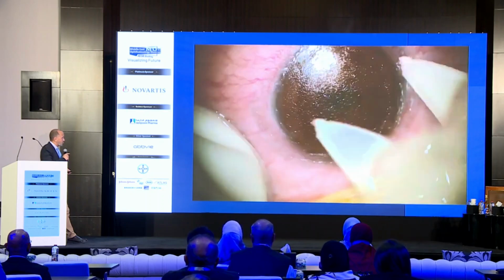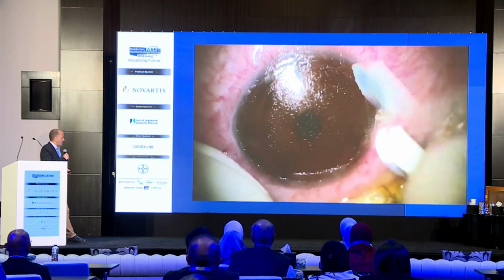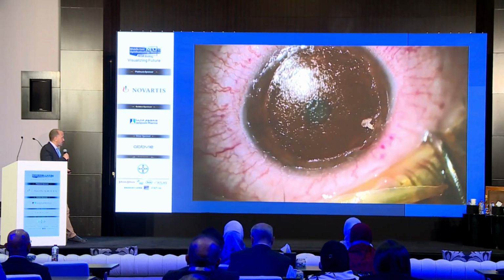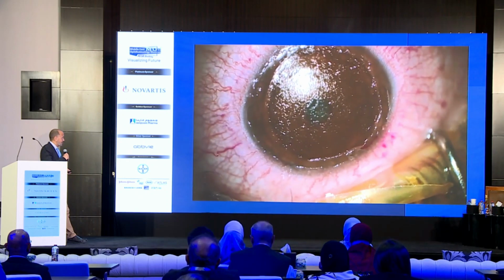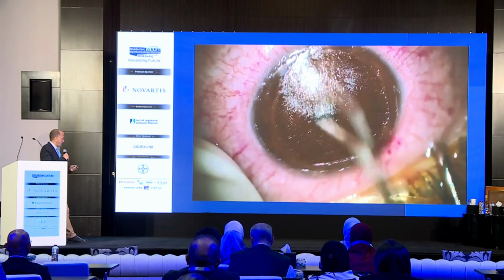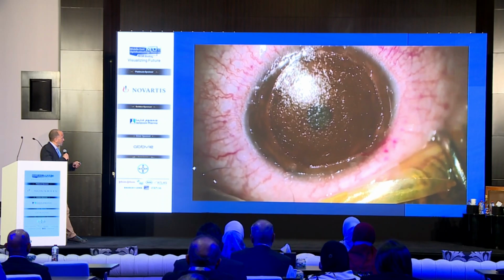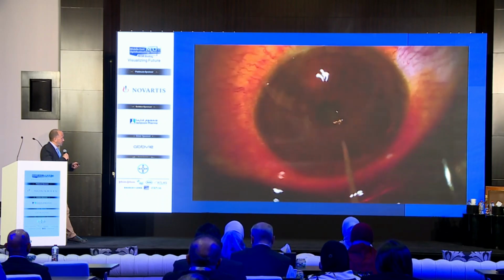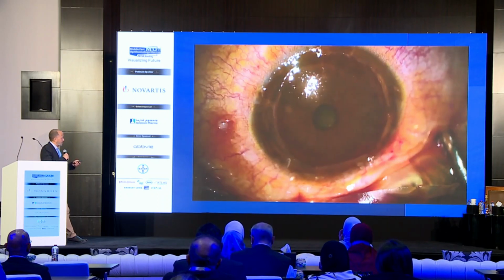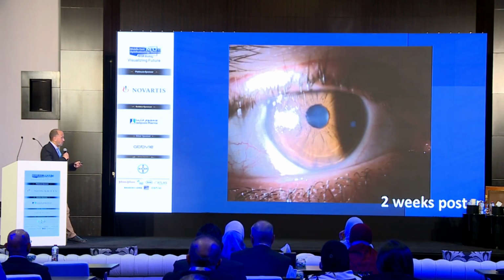Now the stroma started to look a little bit regular, like the stroma that we usually see in LASIK procedures. And by stroma, I mean the bed. Unfortunately, yeah, betadine eye drops and contact lens. A question during this photo. Yeah. If there is any role for PTK to remove this epithelium or no?